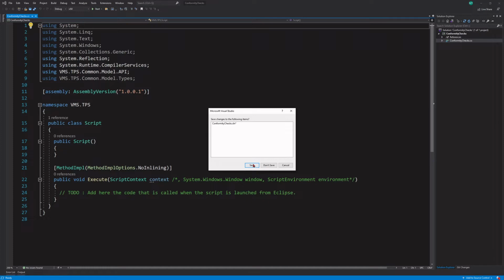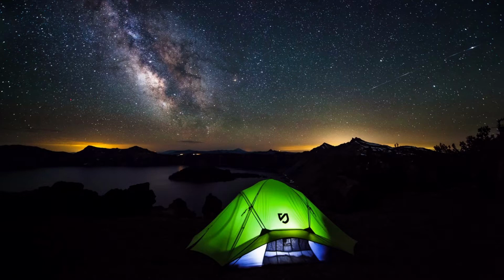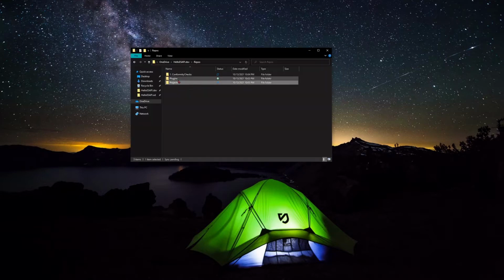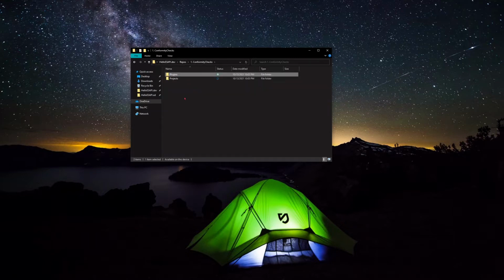Well, let me close this. I'll save it. Okay, now let's move these into there. And so what it did is it created these two folders, plugins and projects, and our C# project is in here, and we just saved that solution. So this is what we'll run when we want access to the DLLs, to the Eclipse scripting API, like IntelliSense. If we want to use IntelliSense, then we'll use this. The script that we'll actually run in Eclipse will be just this single CS file.